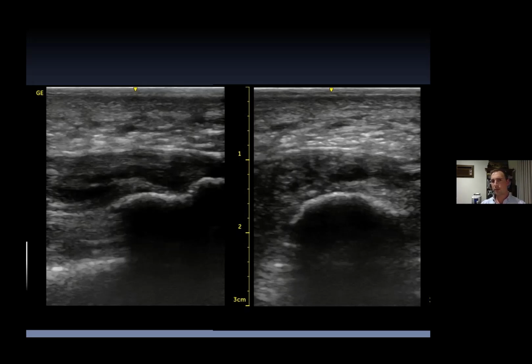Shockwave may have an effect with that. Probably focused shockwave would be more indicated in that. But I have treated patients with osteoarthritis, and again, it's about setting expectations. I'm aiming for a reduction in symptoms and an improvement in some function. But I will much more likely say we do a course of treatment, and then we may need sessions once a month or once every few months, finding that time frame where you space the sessions out to keep the patient moving as a non-surgical approach.